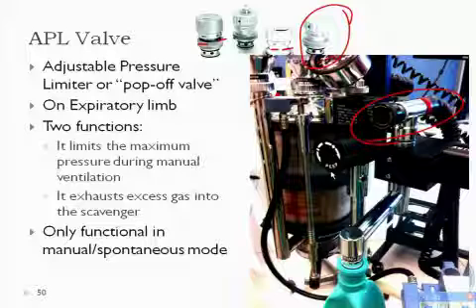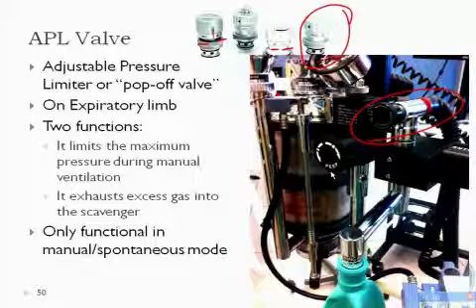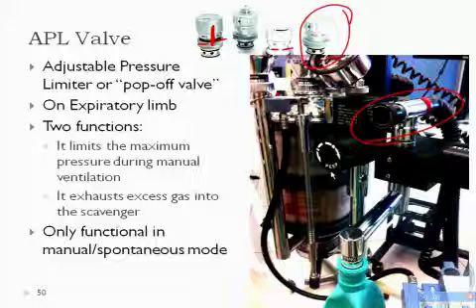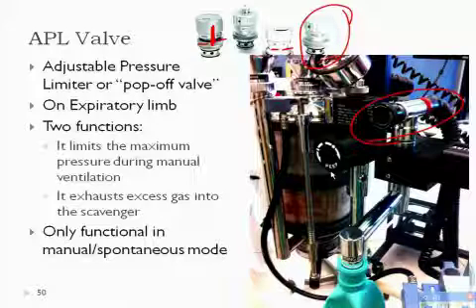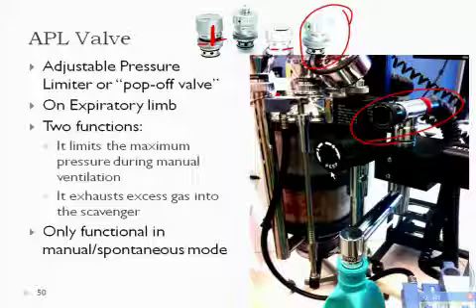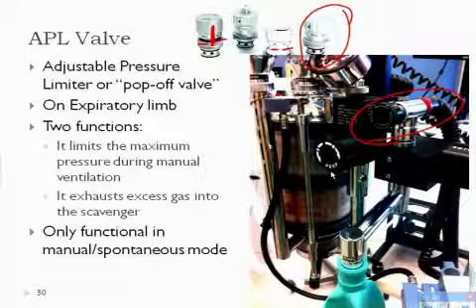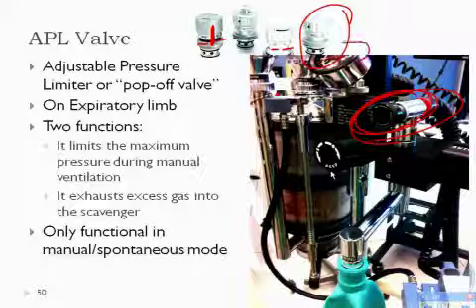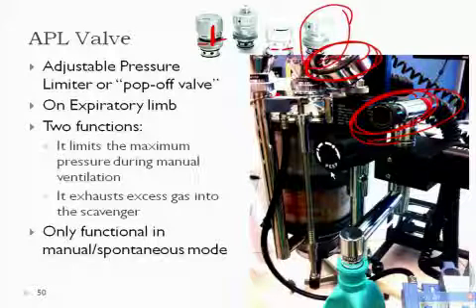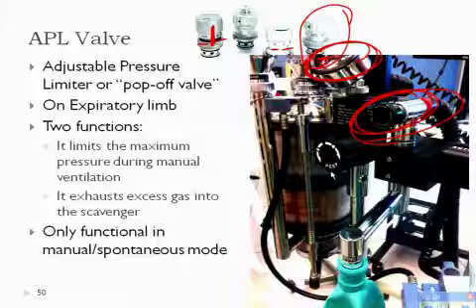All right, so when you're getting people back breathing, you like to set this kind of right in the middle of that minimum and 10. You want to give them 3 to 5 a PEEP, and you give that with the APL valve. Okay, we don't set a number. There's nothing that you push on the machine. You control it with your hand. Okay, so on this machine, there is no number. You simply will control it with your hand, and you'll watch this gauge right here. This is your pressure gauge. This is 10. This is 0. You're going to get them between 3 and 5 or so.